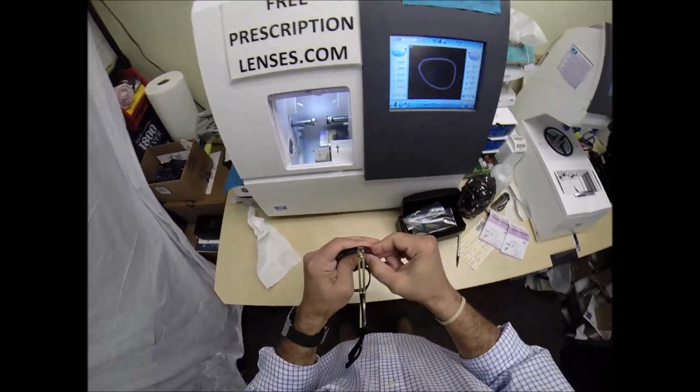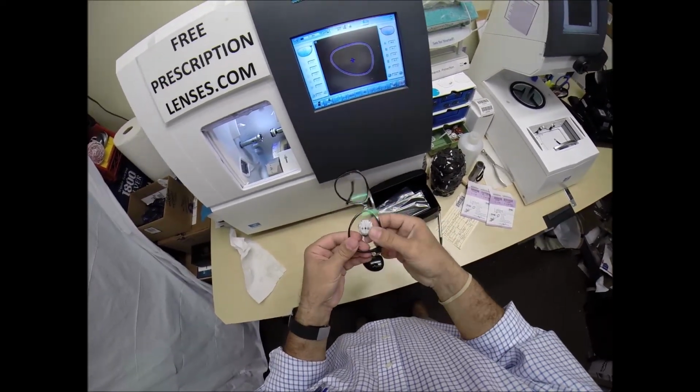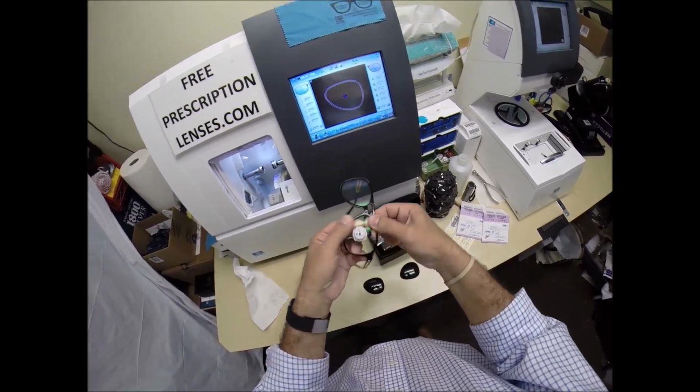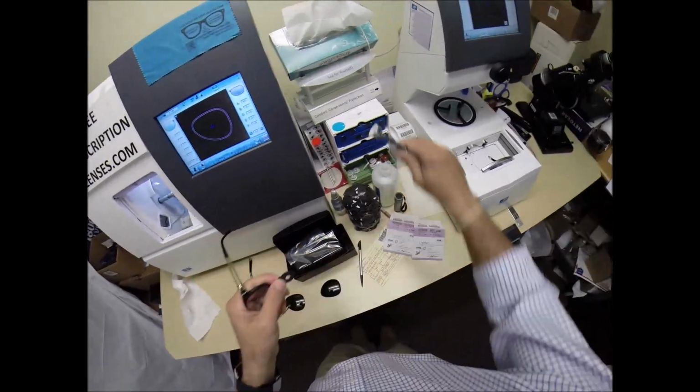There we go. Oh, I'm sorry, I sped that up. I should have demonstrated again. The side I'm working on, closest to me, tuck the lens in at the outside corner. Holding it in place here, that is tucked into that bevel, and then with the thumbs, push down the nose. It's that easy. Pop the block off, dry that off.